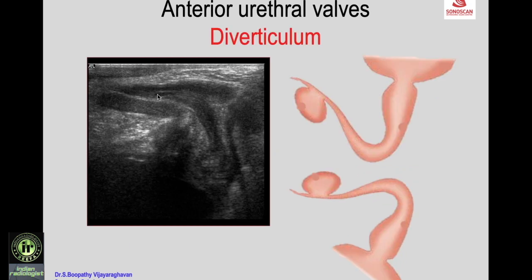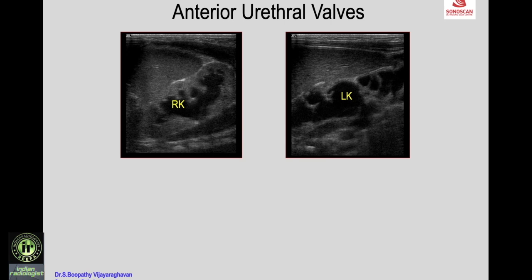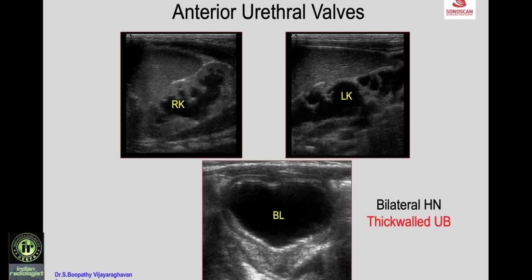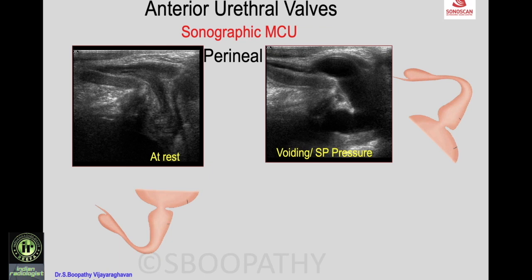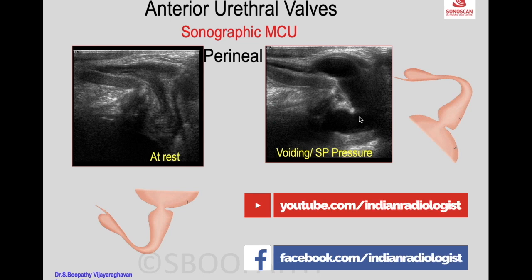On perineal scan in a child, the bladder, pubic symphysis, and urethra are seen with a normal-appearing urethra but a small oval cystic structure indicating an anterior urethral diverticulum. When the child voids, urine enters the diverticulum and causes obstruction to the urethra. In another child with bilateral ureteronephrosis, perineal scan shows a normal urethra at rest with the diverticulum, but on voiding, gross dilatation of the posterior and anterior urethra up to the diverticulum is seen.